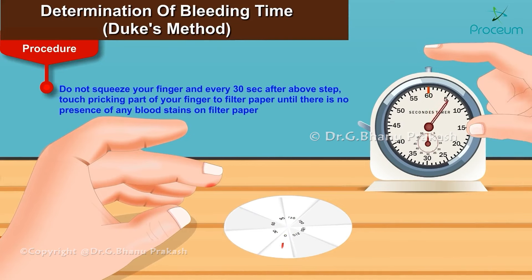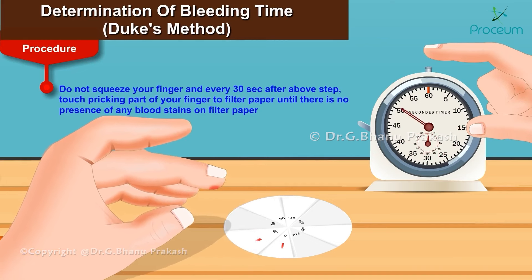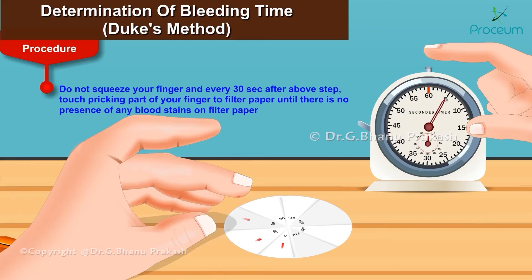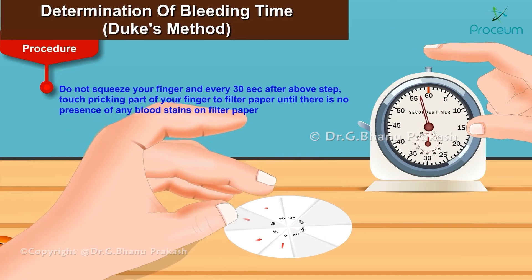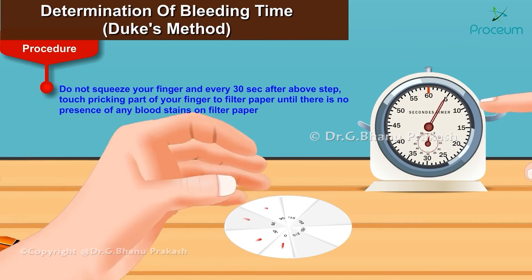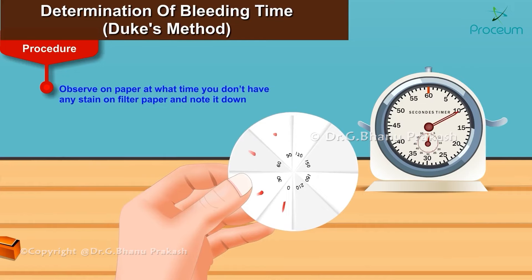Do not squeeze your finger, and for every 30 seconds touch the pricking part of your finger onto the filter paper until the filter paper is devoid of any bloodstains. Observe on the filter paper the time where it is devoid of any bloodstains and record it. This is the final time of the bleeding time.